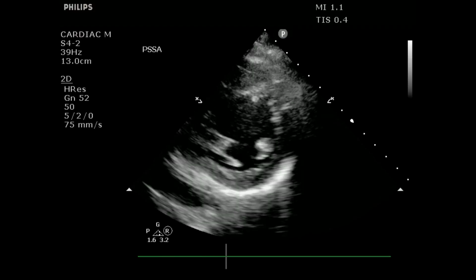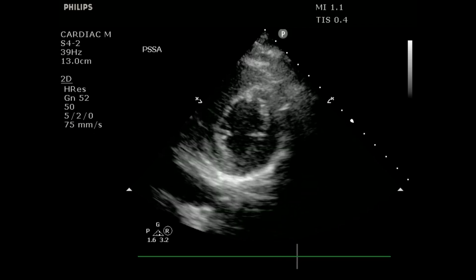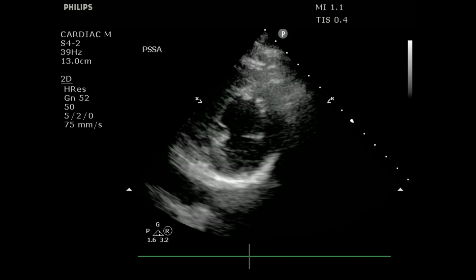And so when you do this one, you've already found the parasternal long, right? So here's an example. It's just kind of a catch your eye. This is the donut view, right? Makes you kind of hungry.